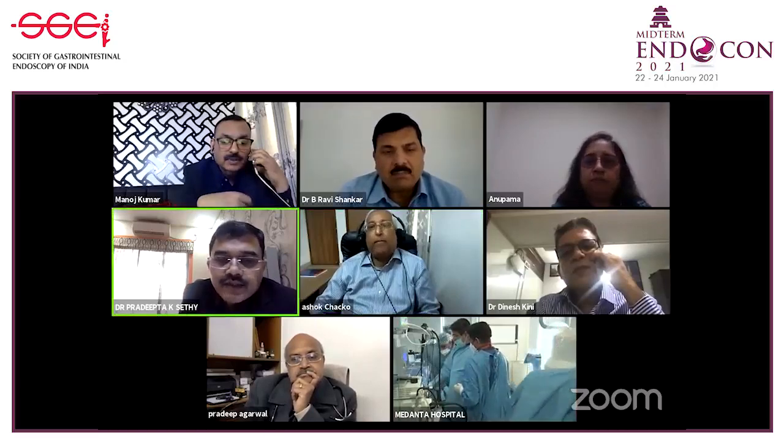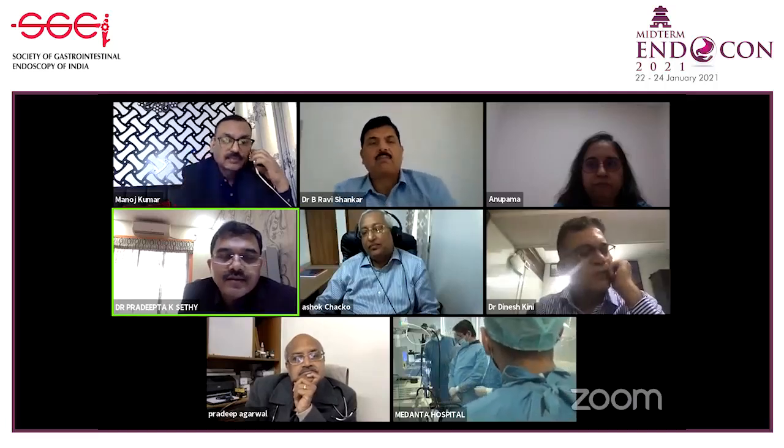Sir, this is Dr. Sethi from Kolkata. Yes. I have two questions regarding capsule retention. We had 6 out of 385 patients in our series with Dr. Goenka, and we had to operate on 3 patients. So what do you explain prior to the procedure, whether they might need a surgery at some time? This is one question. Second is, in some patients, because of maybe gastroparesis, quite a time we see the capsule is in the stomach, 2 hours, 3 hours. And in those patients, what do you do?